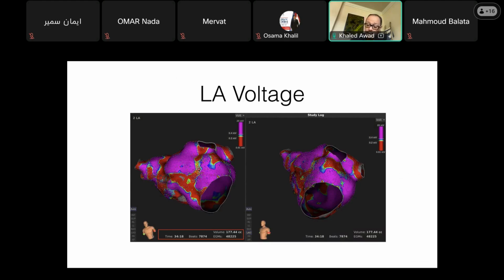I will show you another one. I'm sorry. You know what? I actually do have another example and I would like to show also. Hold on. Was it after AF ablation, and atrial myopathy or arrhythmogenic cardiomyopathy without AF? Without AF ablation. So that one that I'm showing you there, this is idiopathic. I'm going to show you another one that is also idiopathic.